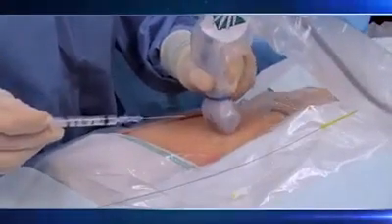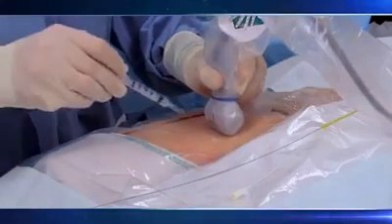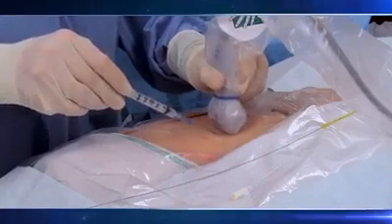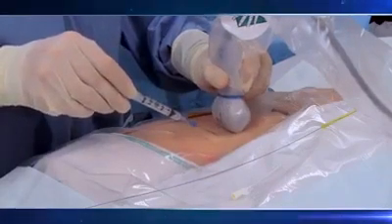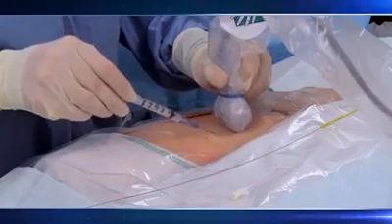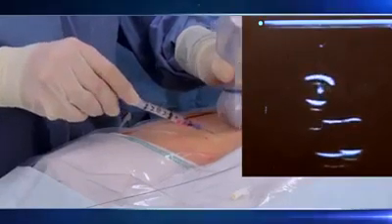Then pick up your ultrasound and place the artery back in the middle of your screen, and the artery will be in the middle of the probe. Place your needle in the middle of your ultrasound probe and begin to insert it at a 45-degree angle with the bevel up. As the needle is advanced, always gently pull back on the plunger. Use the ultrasound to follow the needle tip all the way into the artery until blood is aspirated.